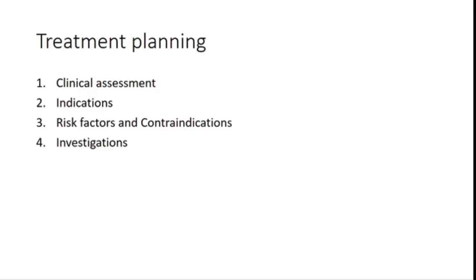Now we go on with the treatment planning. So when you do the treatment planning, the most important thing is clinical assessment, which includes the indications and the contraindications, followed by the basic investigations, so that we are ready for the placement of the implants. So first we'll discuss in detail about clinical assessment.